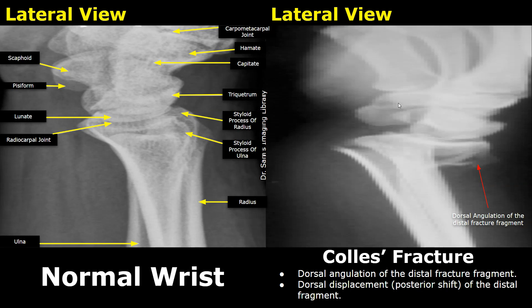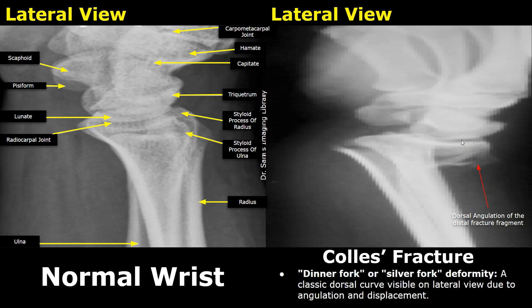This is a lateral view of a different case of Collis fracture. There is dorsal angulation and dorsal displacement of the distal fracture fragment. The dinner fork deformity is also present in this case due to the dorsal displacement and angulation of the distal fracture fragment, which forms a dorsal curve resembling a fork.